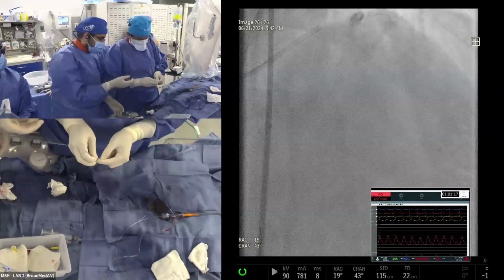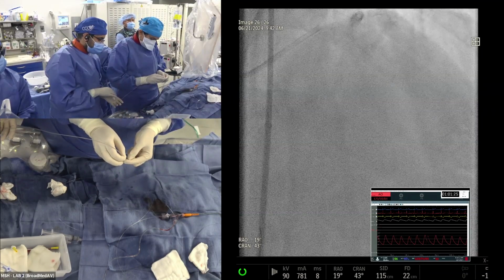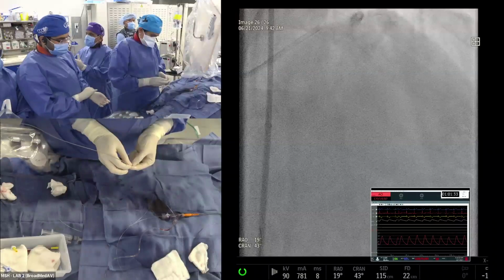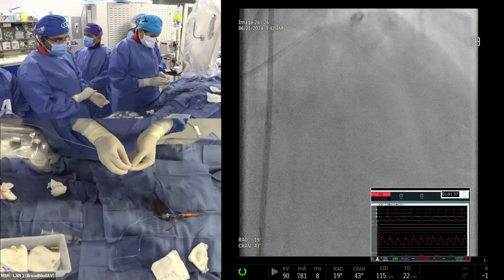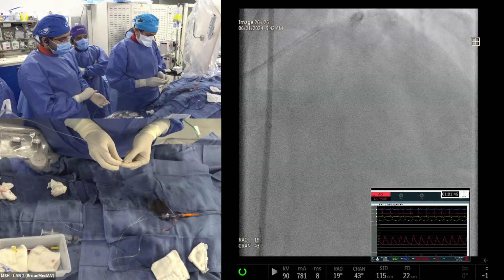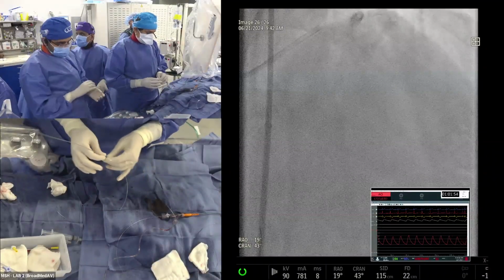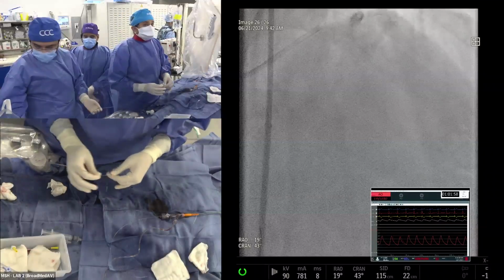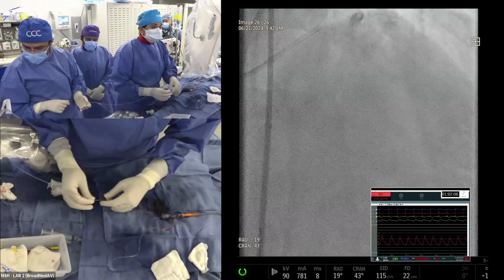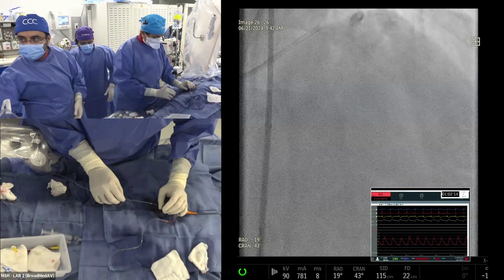So you can make the point that maybe not in every case do you want to do a RotaCut approach. Maybe just a high pressure balloon is good enough in this day and age. The only drawback was that because we wanted to see the effect, not the strategy, we did not undersize the burr in the cutting balloon approach. All were like 0.3, 0.4 burr to artery ratio, and the burr size was equal in both groups. Would a smaller burr in the cutting balloon group have been better? Better in what? The stent expansion still didn't matter and remained the same in both. So the safety signal was not there at all at the equal burr size used in both approaches. The concept is there, non-randomized data are there, but in truly randomized data, we did not show any benefit of this.